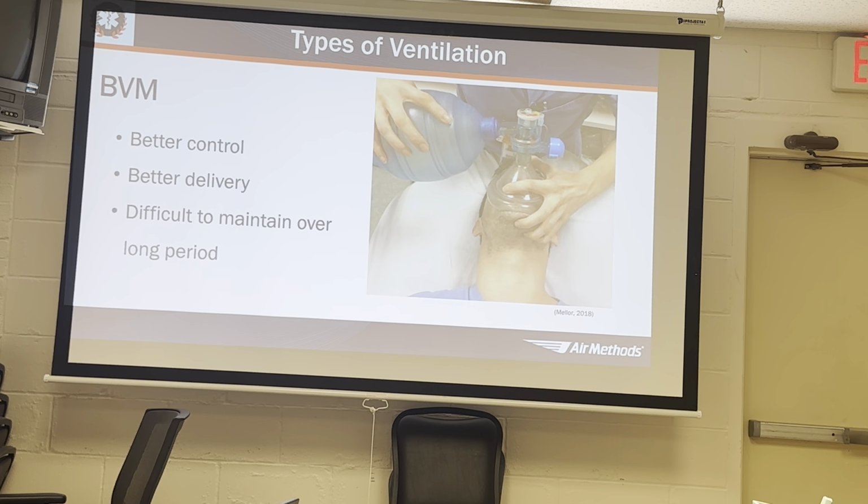BVM is obviously way better. We can control the delivery of oxygen and how much volume we're giving. We can more easily control how frequently we're giving that breath as well. It's difficult to maintain over a long period.